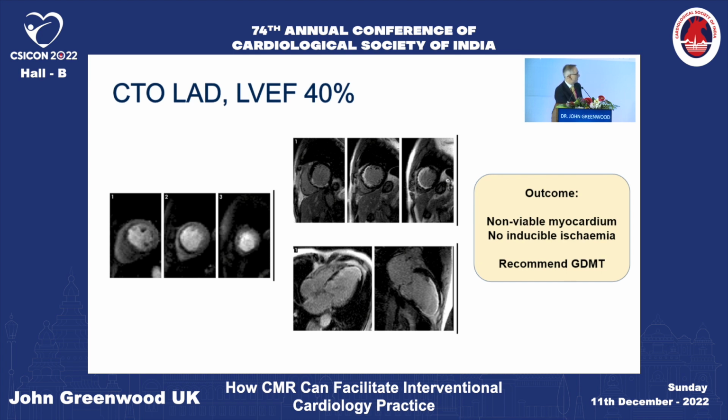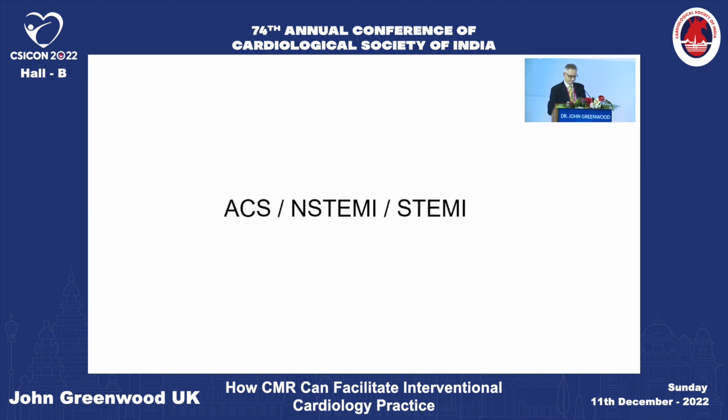You can see extensive scar all the way down the anterior wall and around the apex into the apical inferior wall. So she's got no inducible ischemia, no viable myocardium, and the recommendation for her was guidelines-directed medical therapy.